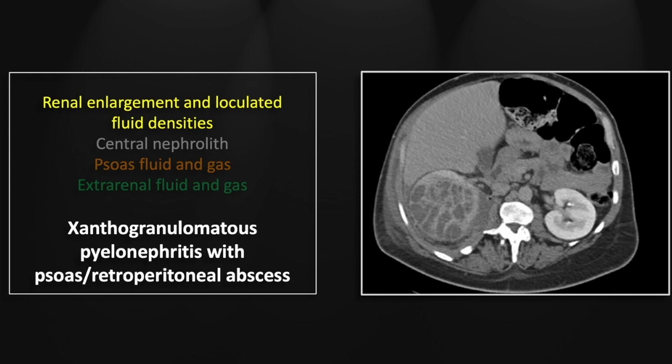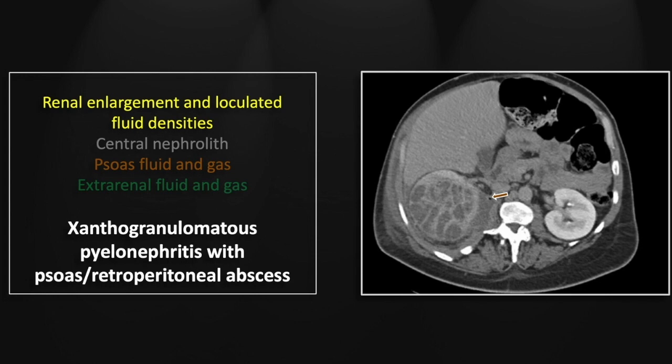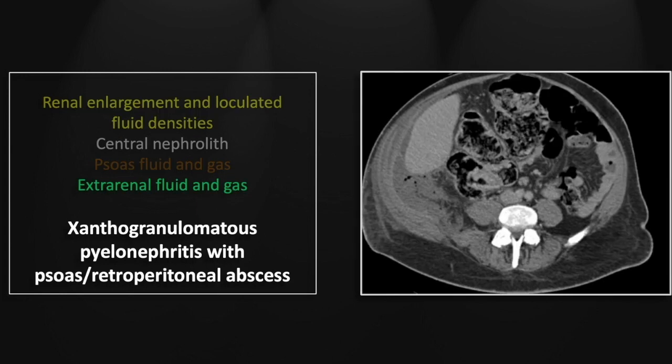Another helpful finding, beyond the renal enlargement, is this extension into the psoas. There is fluid extending from the kidney and there is a small focus of gas suggesting it has an infectious etiology. Over 50% of XGPs have extra-renal involvement, and so it is this in conjunction with the other findings that truly makes this diagnosis.